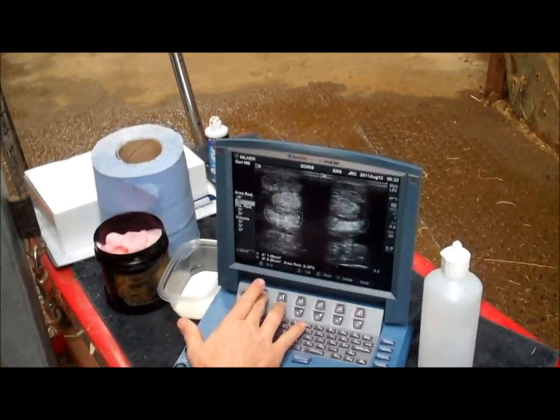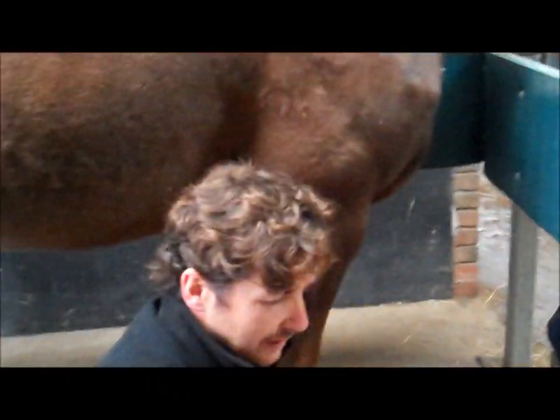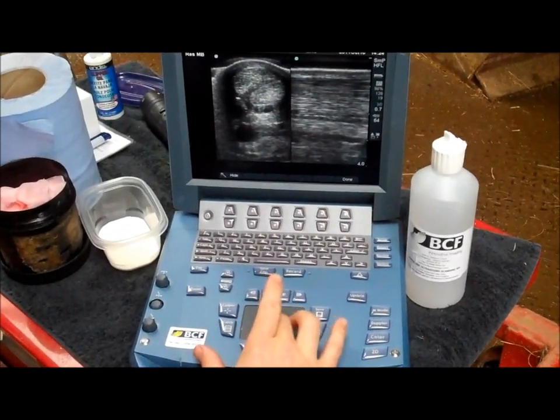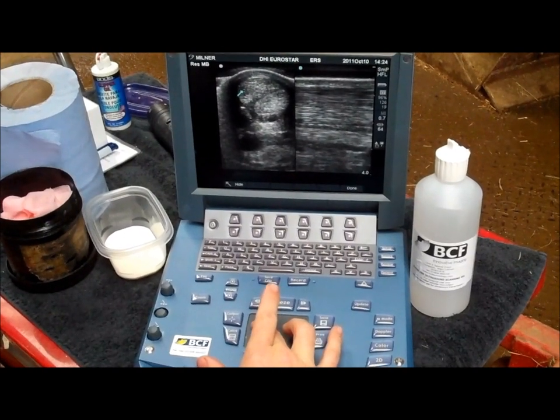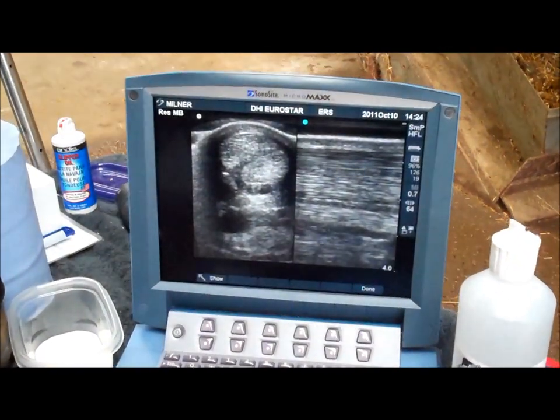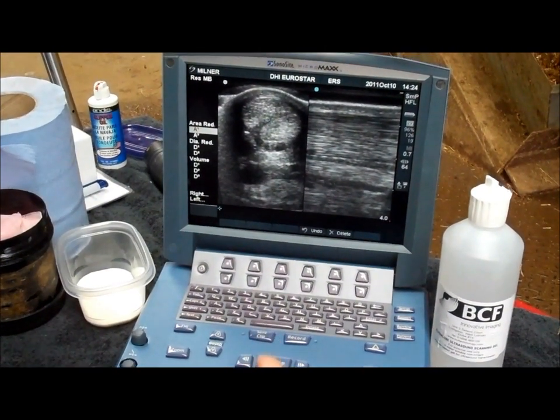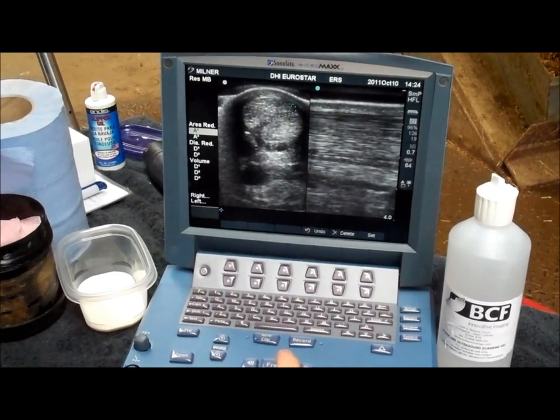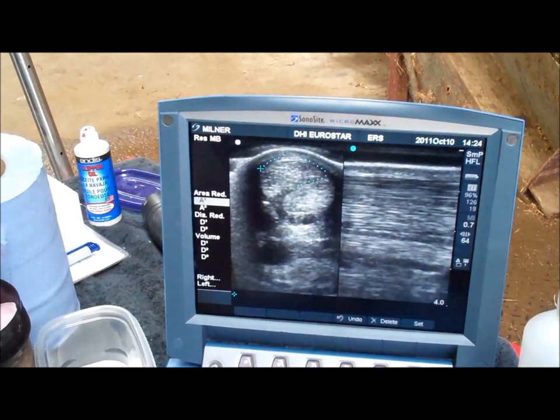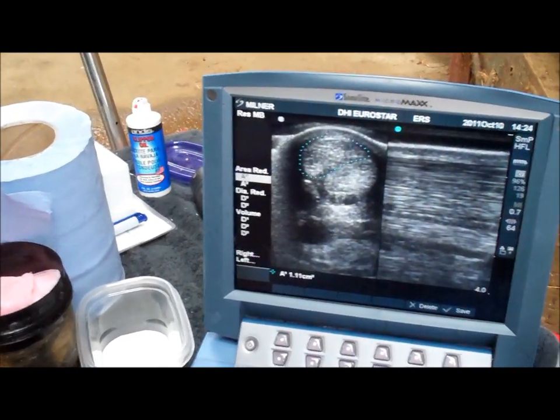We're looking at the suspensory in that shot. I can review my previous examinations before I leave the property and decide whether I need to do any more tests. On this image we've got some really quite subtle changes — just some loss of longitudinal fibre pattern. I'm slightly off centre, so we can appreciate this area here as a slight loss of fibre pattern. We can look at the cross-sectional area of this tendon very easily by using the calculation mode, and we can measure the cross-sectional area of the superficial digital flexor tendon just using the mouse pad to trace around. There we have a cross-sectional area of 1.1.